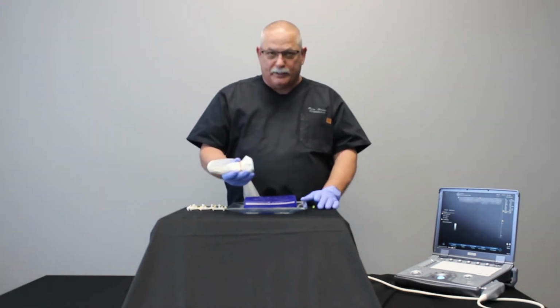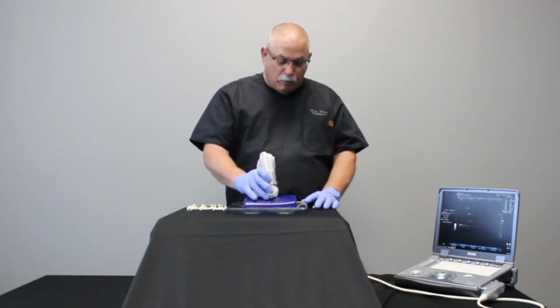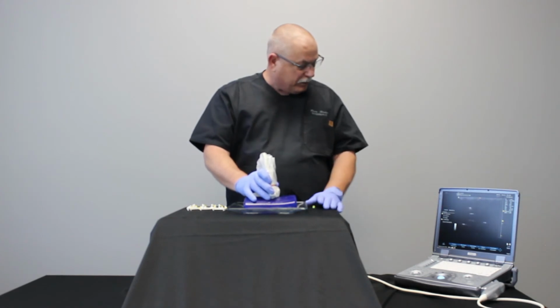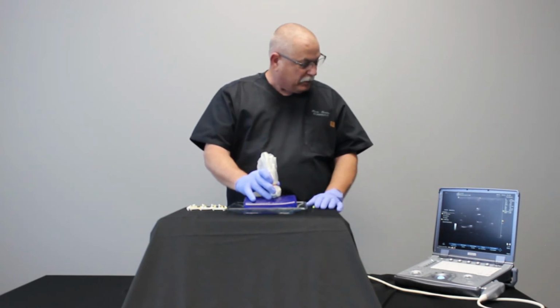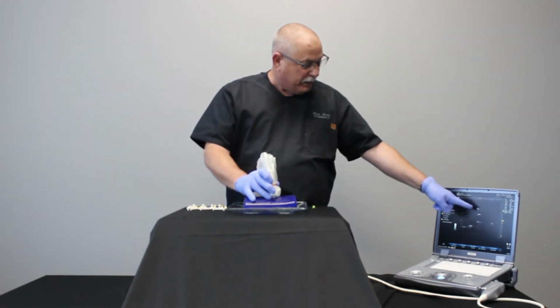So the next step will be to actually scan the patient. Today, obviously, we're going to use a phantom, but I will want to scan while watching my screen over here and locate the particular target. So for today, I'm going to go for this nerve right there. So I notice that it's 1 centimeter in depth.